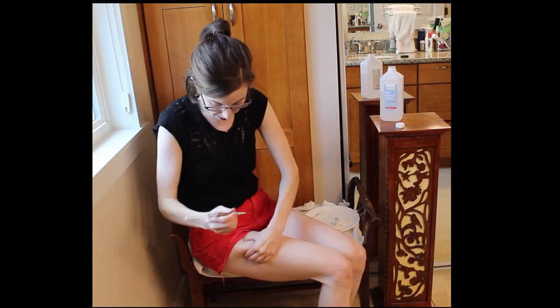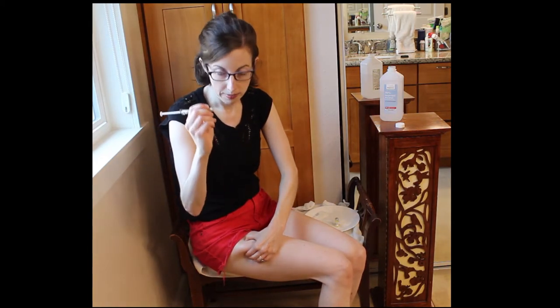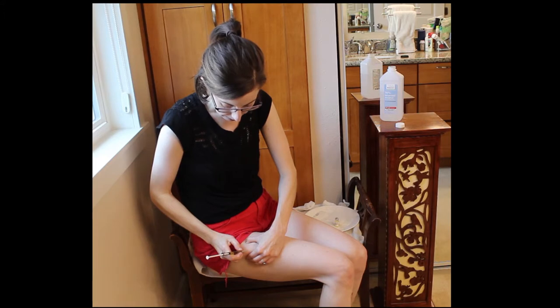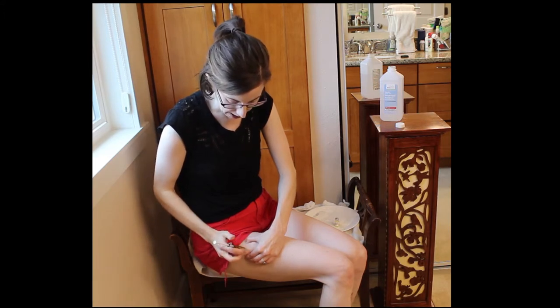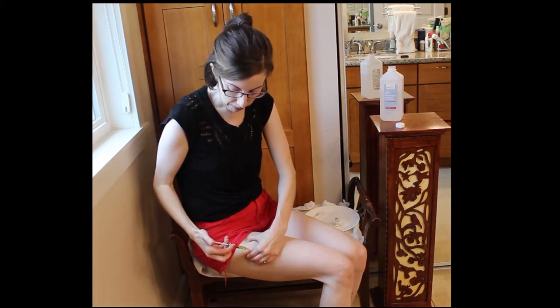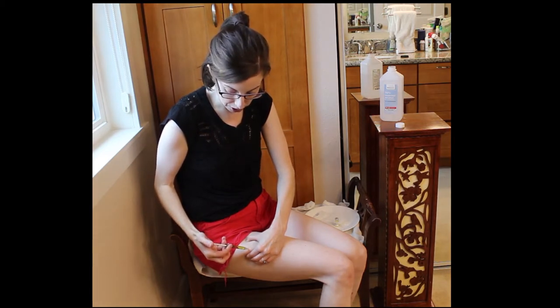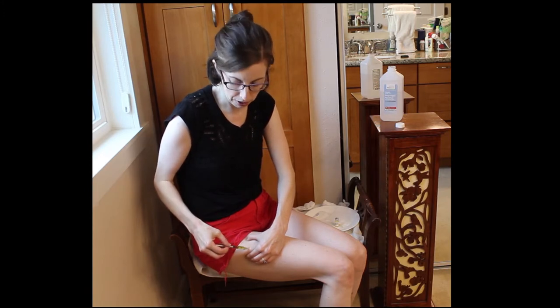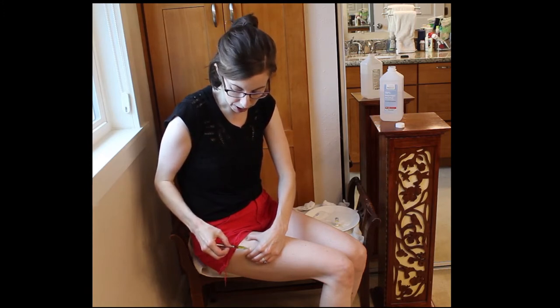Then I pinch it, get my syringe ready, and you go at a 45-degree angle like your other injections, and just push it in. Now, if your thumb doesn't hurt, just go ahead and do it how most people do it, which is pushing down with your thumb. But if your thumb does hurt, you can just position the top of the syringe in your palm and push down like that — so you don't even need your thumb.